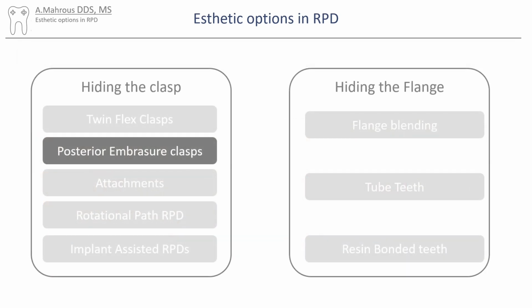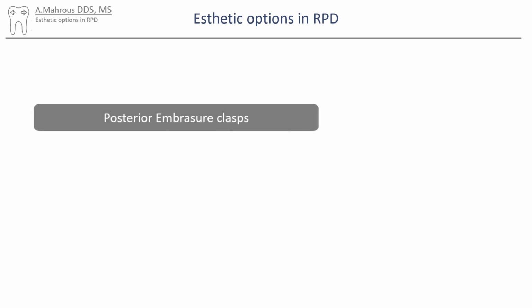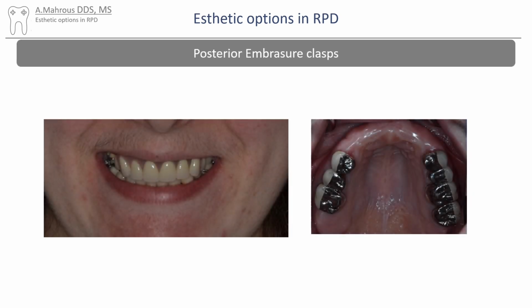Now let's move on to the next option: posterior embrasure clasps. It's often possible to avoid placing clasps in the anterior region, where it would be possible, by placing embrasure clasps in the posterior region, like this case. This patient had amelogenesis imperfecta and had to lose all her anterior teeth. We're able to avoid having clasps placed on the anterior teeth where it will be visible by placing embrasure clasps on the posterior surveyed crowns.